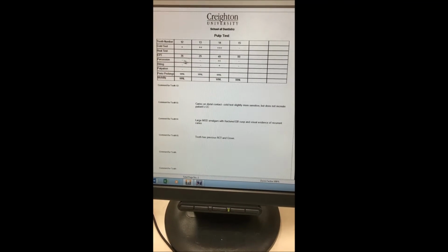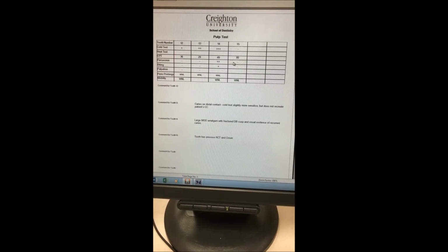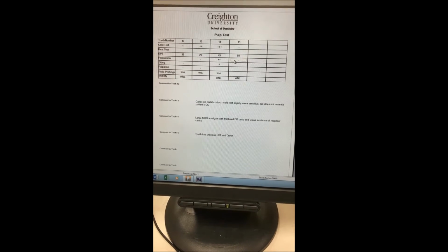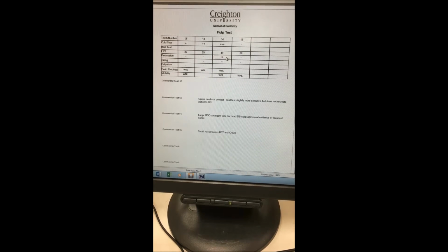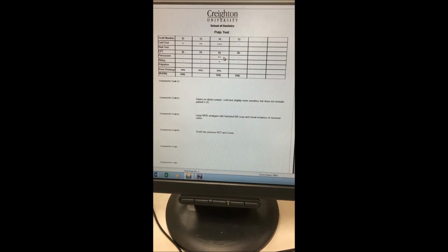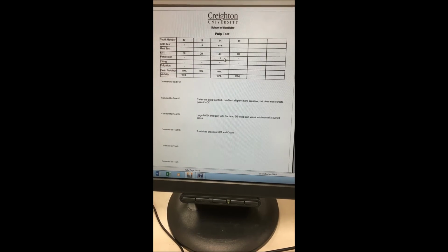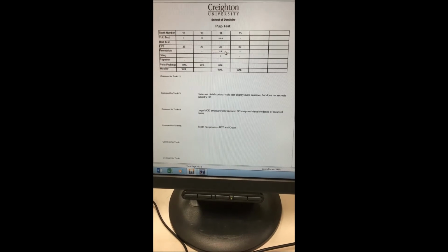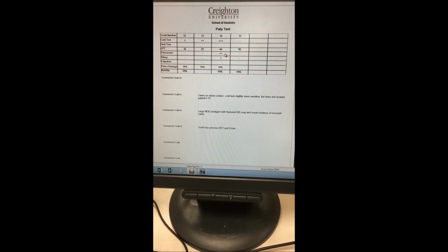So if you put plus, plus, plus, plus for all of those, but percussion hurt on one, we don't know which one hurt or which one hurt more. So putting 2 pluses for things that hurt, or 3 pluses, or 8 pluses, I know some people say that's excessive, but it definitely describes the patient's response well if they responded with an extreme exaggeration to percussion or biting or whatever you might be talking about.